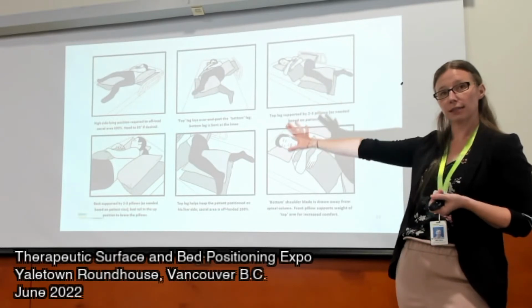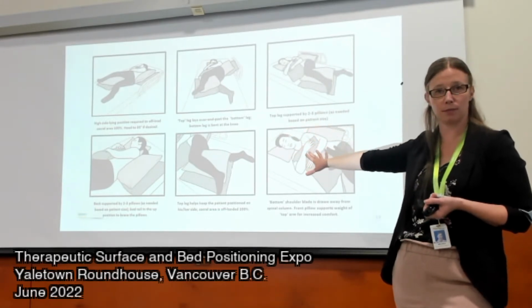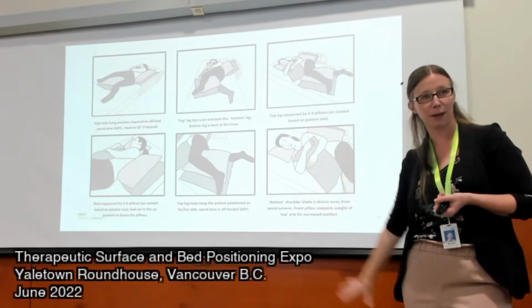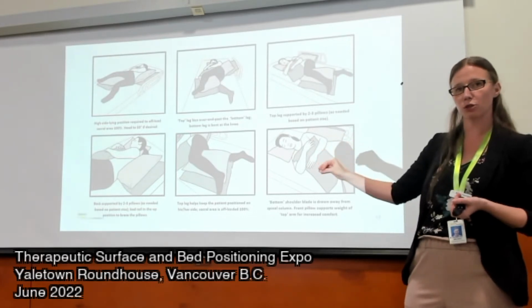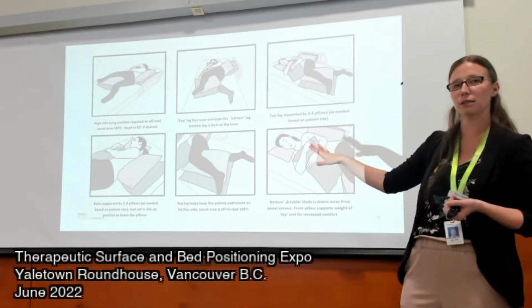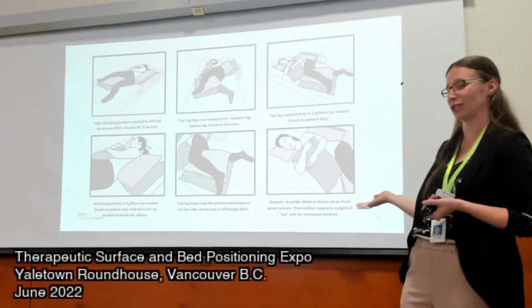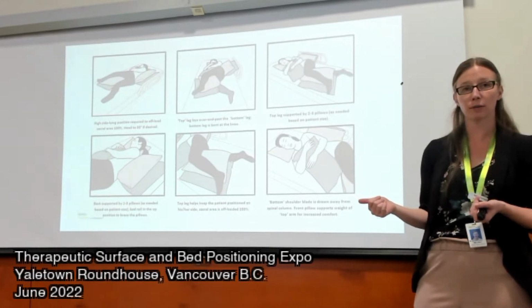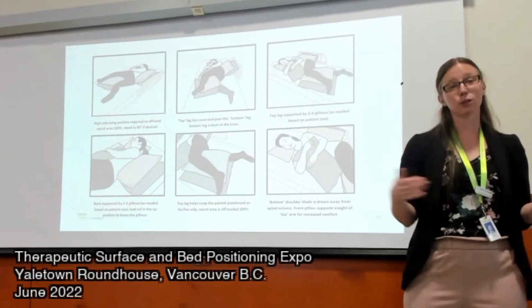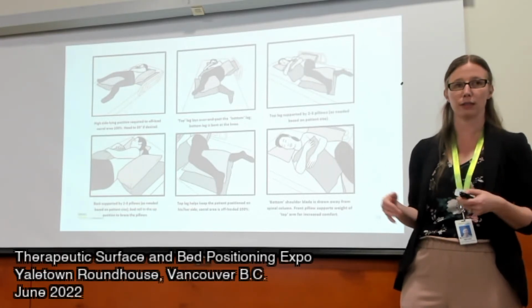This is great, but I never found this many pillows when I was working in long-term care. So if you have somebody who is at risk or has pressure injuries and you need to do something like this, we would really recommend getting some positioning devices. The positioning devices will hold their shape better. Because they're going to hold their shape better, they will also provide more comfort for the resident.